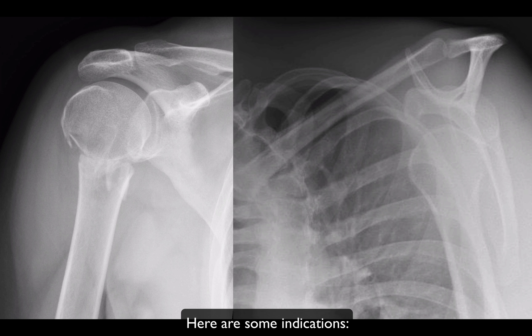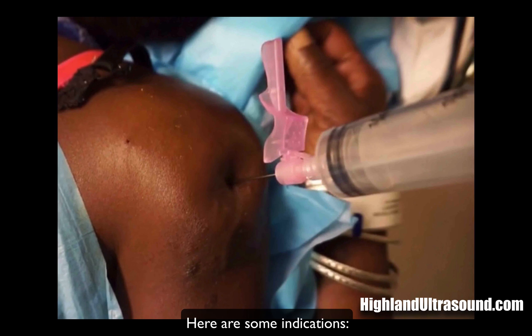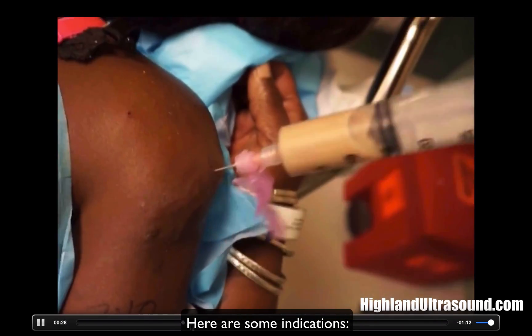Here are a couple of indications I've used it for: proximal humerus fracture, shoulder dislocation, and one that's been described in the past is a deltoid abscess. This picture I got from Hyland Ultrasound — there's a juicy abscess in here. This might be a reason to do an interscalene block.